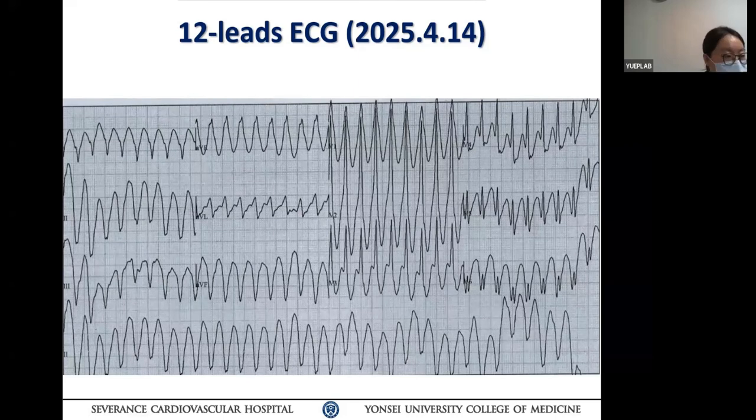Also, that is evident in V4. If you look at V4, at the end of the S segment, right there, that small notching. Come back, yeah, there is another one, another one, another one. But timing changes a little bit, right? So you've got a very fast tachycardia going on there. So that much you can get out of this, okay?